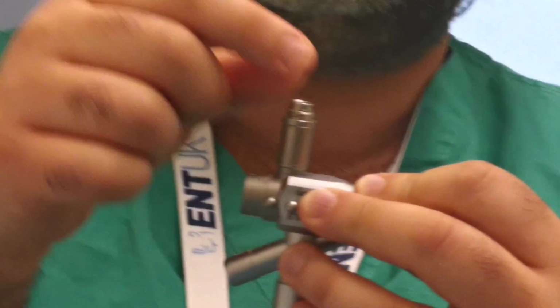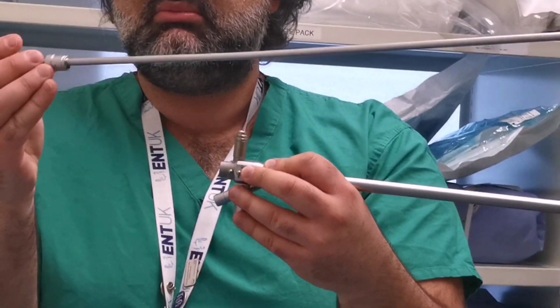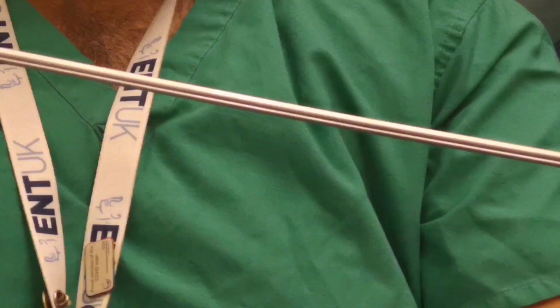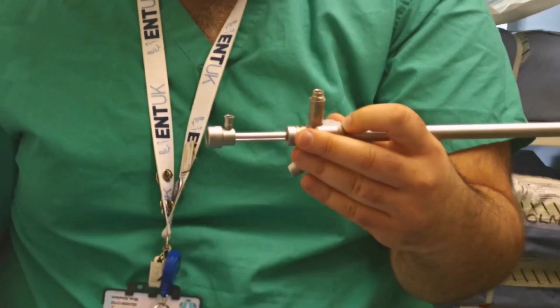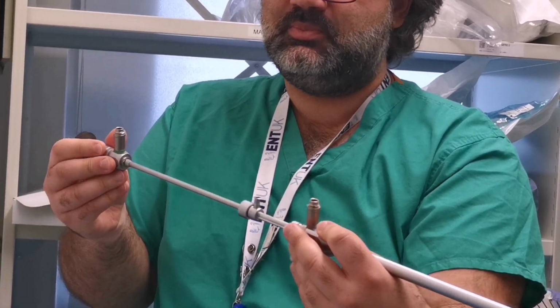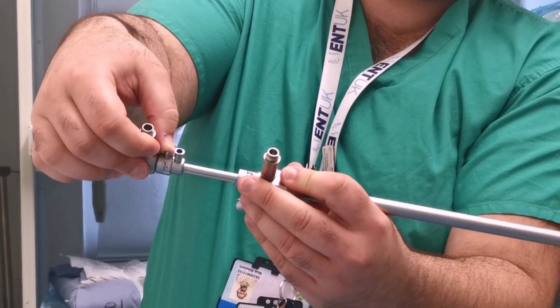This is necessary even if you don't want to attach your light lead here, because otherwise you would not be able to attach the rest of your instruments. Then next would be, essentially, we have a guide for the optical forceps. It's like a sheath that goes inside to protect the optical forceps, and again, everything points up, so it locks, okay, and then you put your optical lens, okay, again, easy, everything is pointing up. So for the time being, it's unlocked, so it's not pointing up, it's pointing horizontally, but for everything to lock, you just have to point it up.